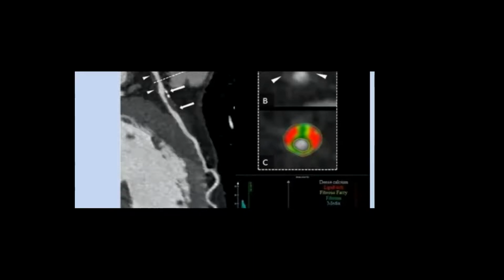But if it's larger than that, it might even be good news. Then it indicates healing of atheroma. So the calcium, you can't take it categorically bad or good. It depends on the size of the plaque and the pattern of the plaque, whether it's spotty or large sheets covering the plaque.